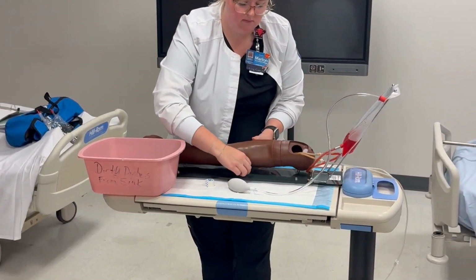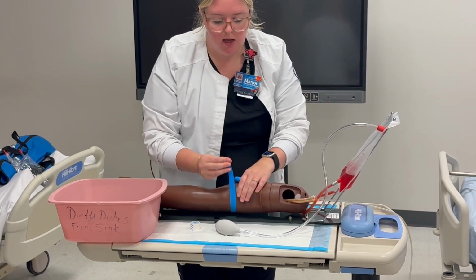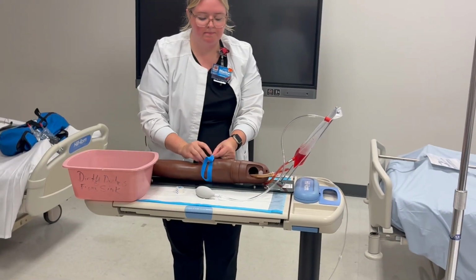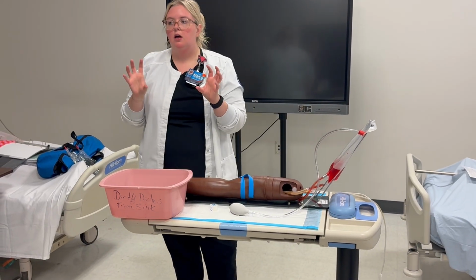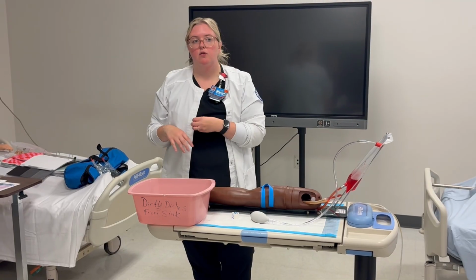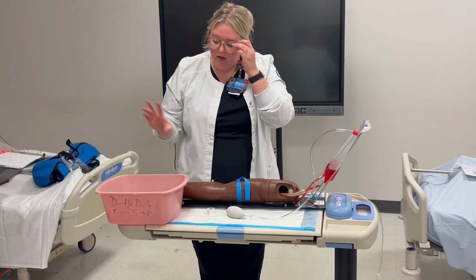Says to do the second medication check before you do the IV. Does the medication check matter? It does matter in that sense. So before you do the IV, do your second medication check. Okay. Yep, write down: you do your first one in the med room, second one at the bedside, and then your third check occurs right before you give the medications. Thank you for reminding me.